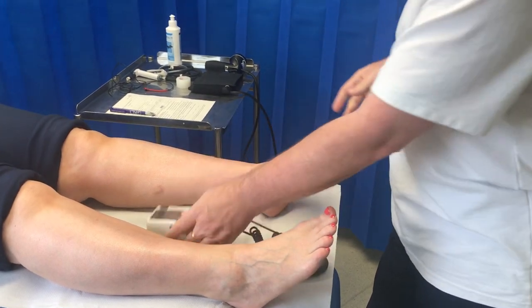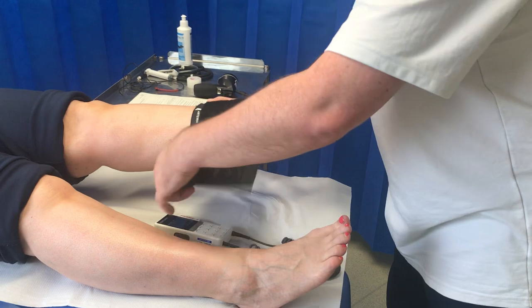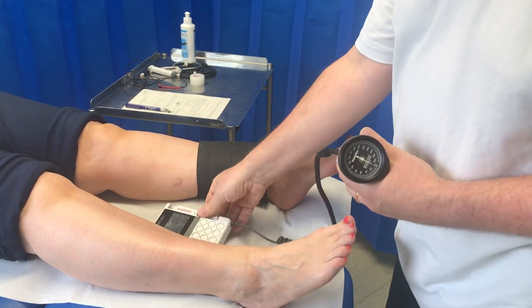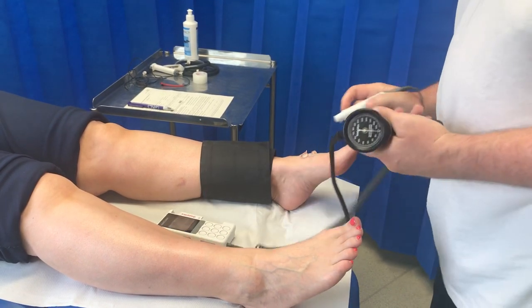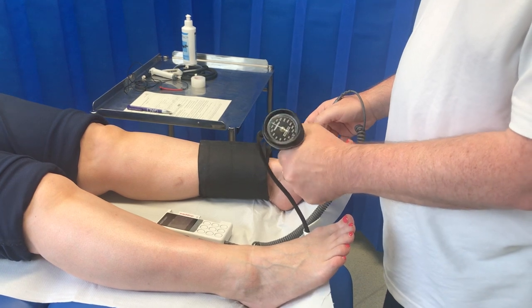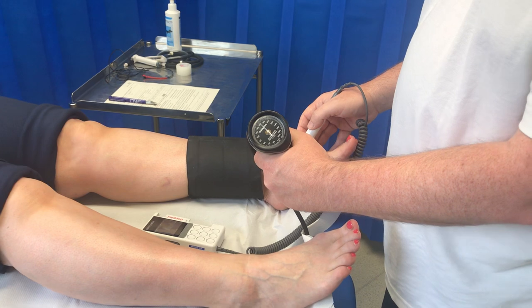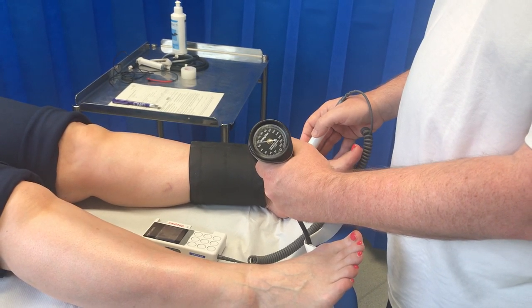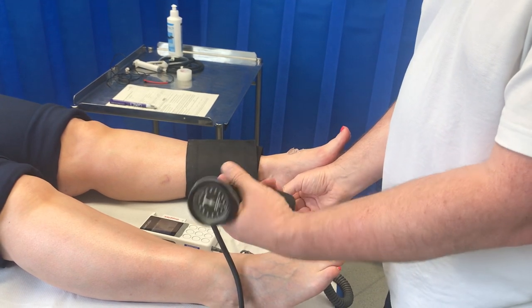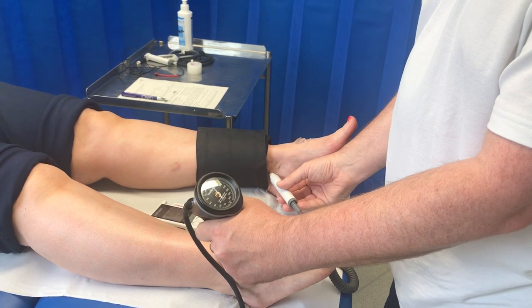Once I've listened to all three pulses, I'm next going to take a pressure on the ankle. I'll get my cuff and put it around the patient's ankle, about two centimetres above the medial malleolus, as parallel wrapped as best I can. I'll take that in my left hand and use the Doppler in my right hand. I'll close my valve and go back onto the dorsalis pedis pulse, then compress the cuff until there are no more sounds — up to about 180 mmHg — then come down slowly on the trigger, waiting for the first sound returning. I'll then repeat that on the posterior tibial pulse, locating the pulse, closing my valve, inflating the cuff, and taking the pressure on the posterior tibial artery.